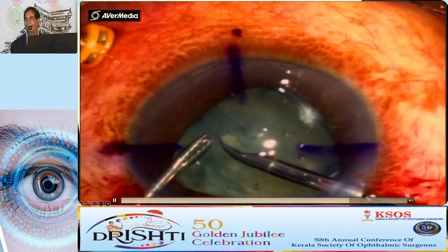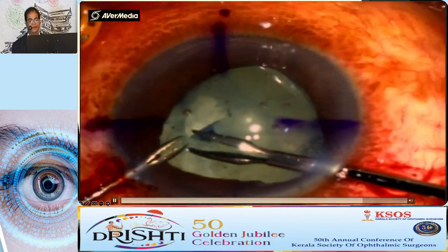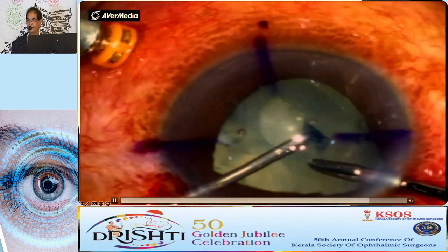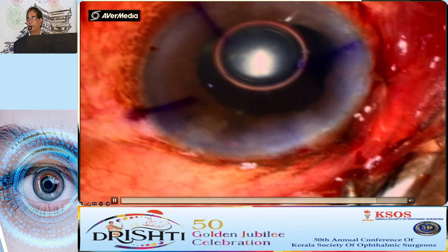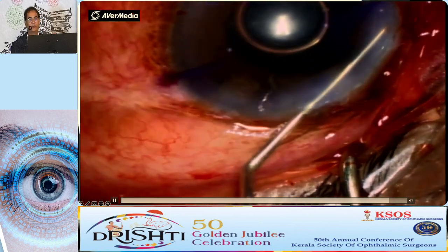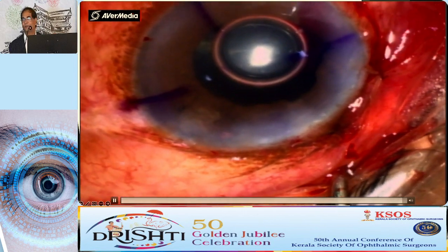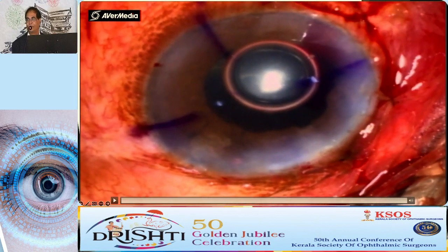You make a nick, and then with the nick you can make a cut with the vitreous scissor, and then you hold one end, and with the other microforceps you can hold the other end. Now this is the important thing which I want to show you in this. I was very happy I had done it, but at this stage you can see what has happened. So you have to be very careful when you're using a spatula, because all the good work is gone.